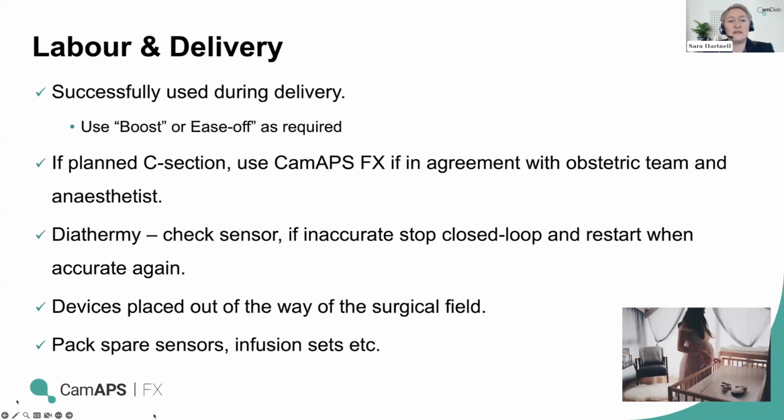And then through labour and delivery, we've seen many times the system being successfully used during delivery. It gives women much greater freedom than having to revert to variable rate insulin infusion. The use of Ease Off and boosters required during delivery is absolutely fine. If there's a planned C-section, then the CamAPS FX system can be used in agreement with the obstetric team and the anaesthetist. We generally don't see any issues with that now. People are familiar with it.